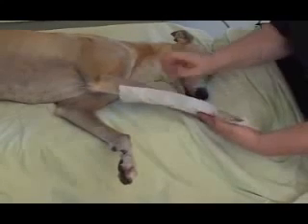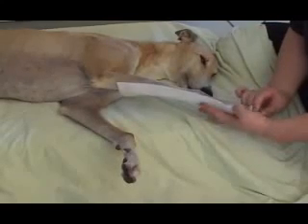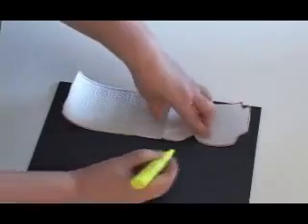After you have cut out the pattern, check it against the animal's limb to ensure that the length, width, and angle notches are correct. Make sure that the distal part of the pattern is large enough to accommodate the animal's foot. Using a waterproof marker or wax pencil, trace the pattern onto the thermoplastic sheet.